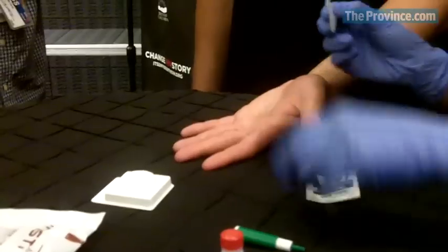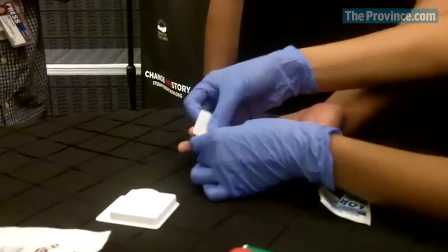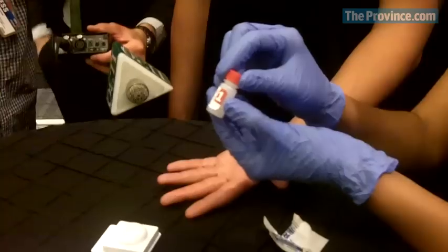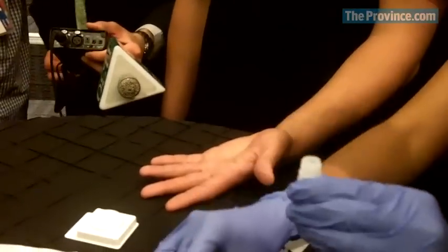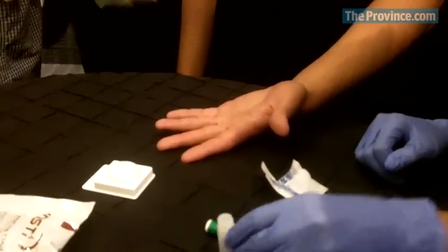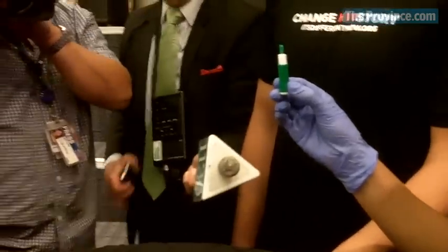So this is a rapid HIV point of care test. What I would do is take Aaron's finger and just give it a good squeeze. Then I would take the alcohol swab and just clean the surface of his finger, and as I let that dry, I go ahead and get bottle number one ready, and this is what I use to poke Aaron's finger.